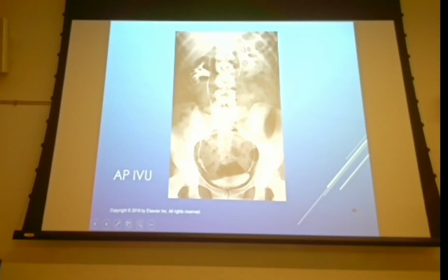But that's what you should be looking at, is you see how the ureter tapers down, right? And it goes across the transverse processes across the pelvis into the bladder. And they're not ectopic. You see the left kidney higher than the right kidney. Everything is fine. Sometimes if a patient has a kidney stone, the kidney stone might lodge right as it comes across the pelvis.